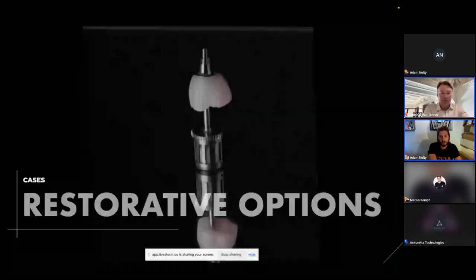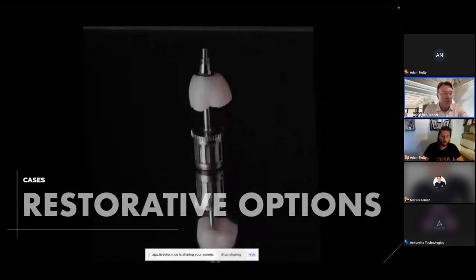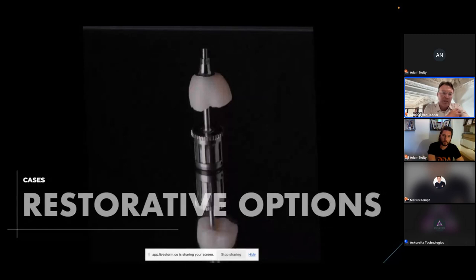So restorative options, Kim. Yeah, so what are our restorative options when it comes to 3D printing? At the moment, if we backtrack a few years, our restorative options on direct 3D printing were zero. I mean, restorative options now have changed. But what we use in practice these days is really a combined printing and CAD/CAM manufacture.